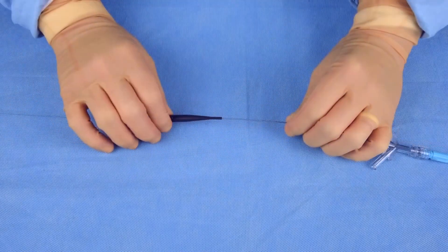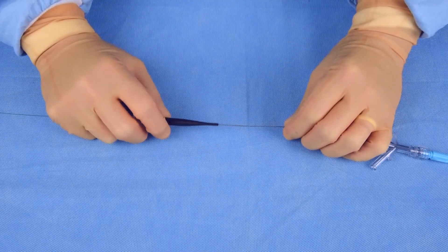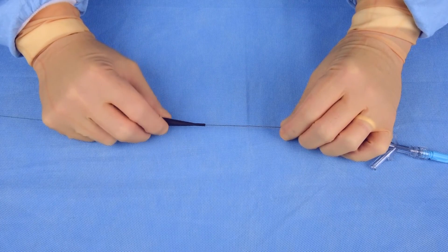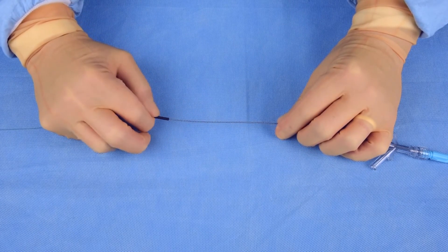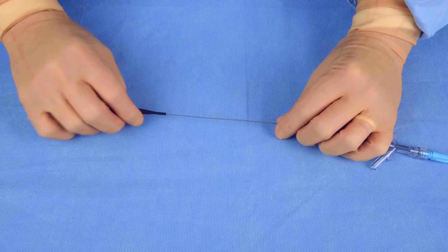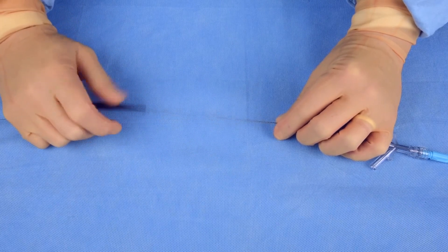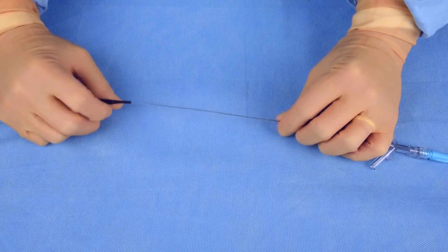If resistance is encountered while removing the turnpike catheter, fix the guide wire in your pinky finger of your right hand and rotate the catheter in either clockwise or counterclockwise directions while gently pulling on the catheter with your left hand to remove.